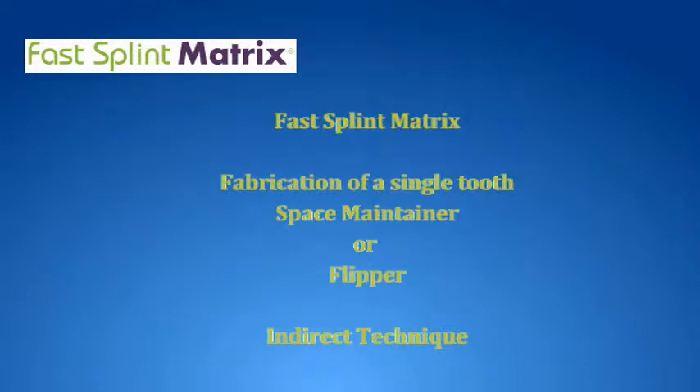Welcome to this step-by-step technique video on the fabrication of a single tooth space maintainer or flipper using the Fast Splint Matrix technique, indirect method.